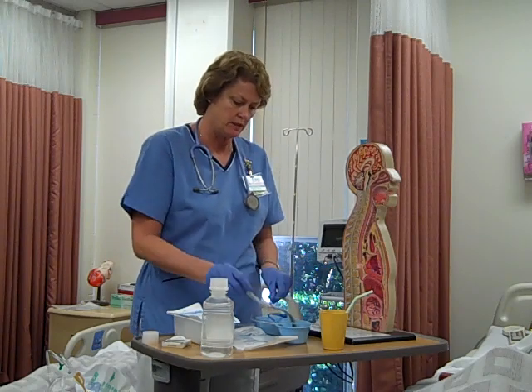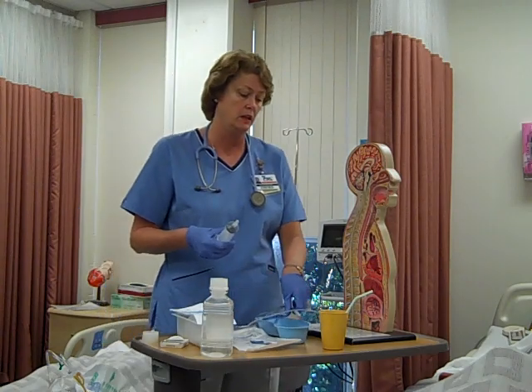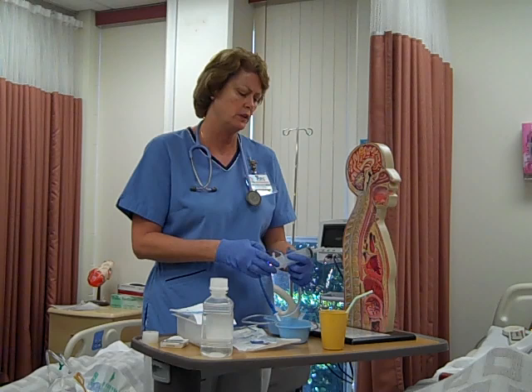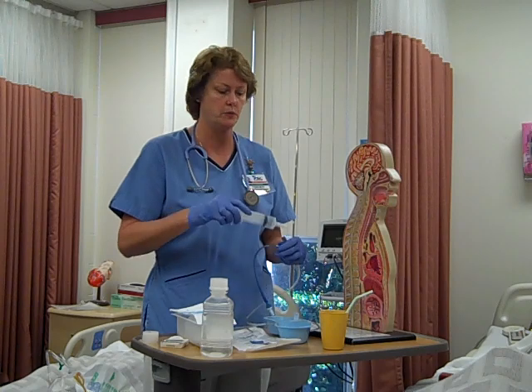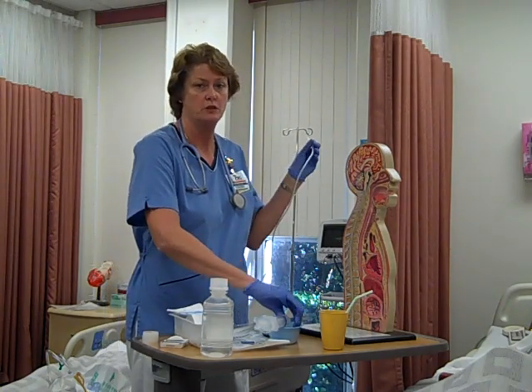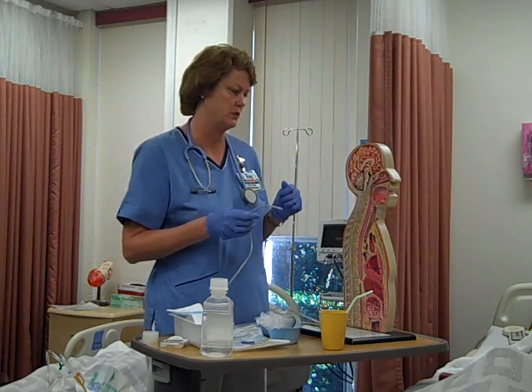We're going to loop this up about four inches. If this is a patient with a distended abdomen and you're putting it to suction, you can go ahead and put your syringe on the end of the tube. We're going to be checking placement with 20cc of air — you can load your 20cc of air in the syringe and hook it up to the end of the tube while you're getting ready. A hand signal for the patient is also important — establish ahead of time that if they want you to stop, they can raise their hand.